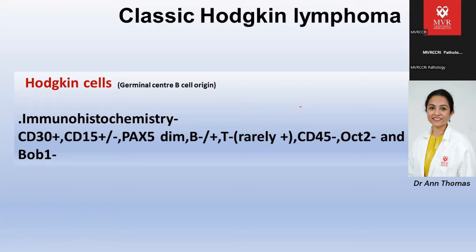An immunoblast would be positive for LCA, whereas in our Hodgkin cells LCA is usually negative. LCA usually comes positive in most hematopoietic cells, whether lymphoid cells, neutrophils, or eosinophils. So loss of LCA is very abnormal, and that would favor that the cells are abnormal.